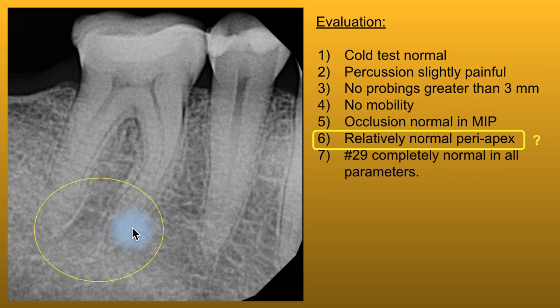Now, when you have acute microtrauma, you're not going to see significant widening of the PDL because the body hasn't had enough time to resorb, through the induced inflammation, a widening of the PDL. You'll often see widening of the PDL with chronic microtrauma or occlusal trauma. But when it's acute, and here we're saying acute based on the patient's symptoms, we don't always see it. At least it's not super relevant. But you can see here that that's different than here. Okay, so why don't we continue to investigate the idea of supporting our diagnosis through microtrauma?